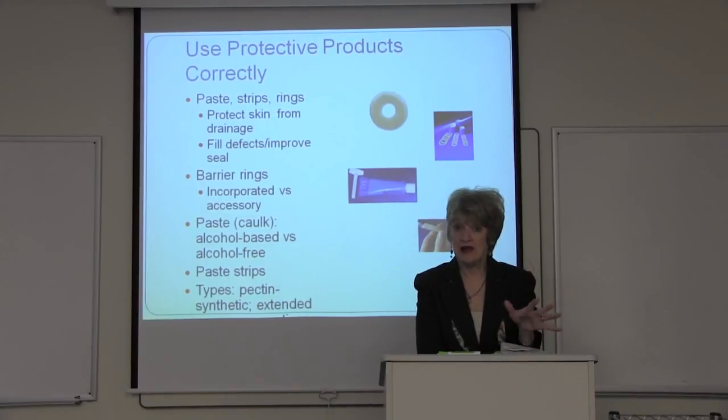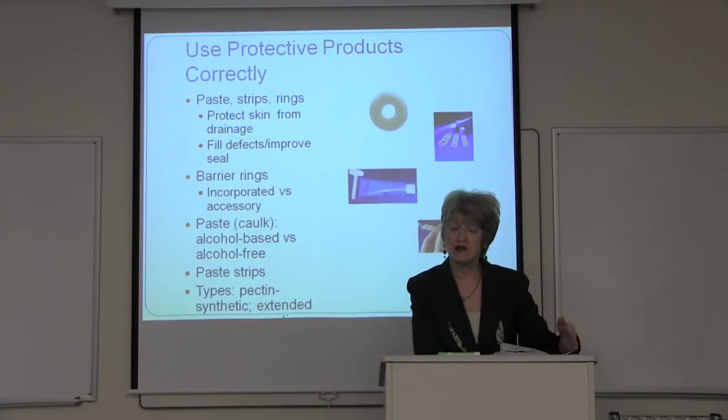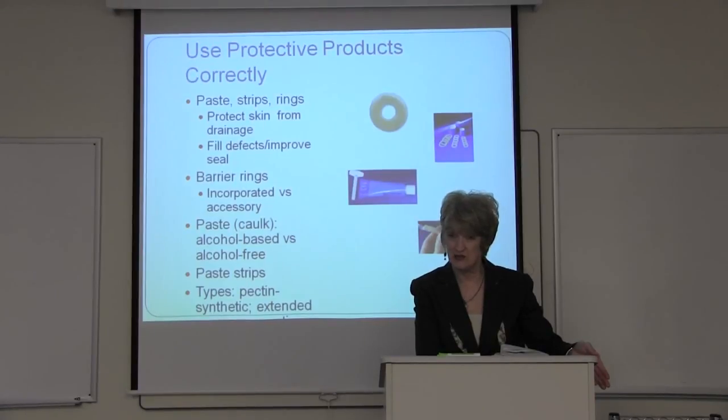The issue is those are the same products that are used in everyone's barrier products. So it's not like I can shift from Hollister to Convatec because I'm still using the same products. It might be a slightly different recipe, but the core ingredients are the same.